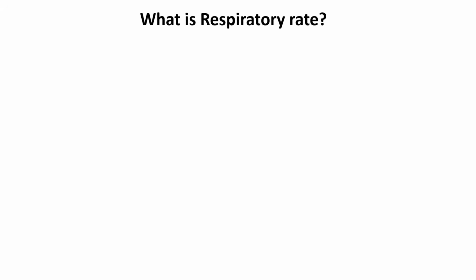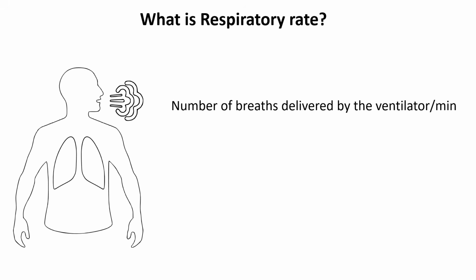Respiratory rate is the number of breaths delivered by the ventilator per minute. For patients with normal lungs, such as those recovering from surgery or under sedation, a respiratory rate of 10 to 16 breaths per minute is typically sufficient to maintain normal gas exchange.